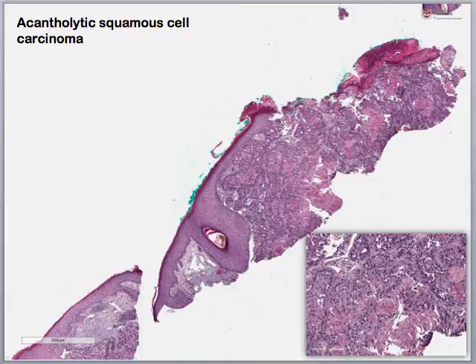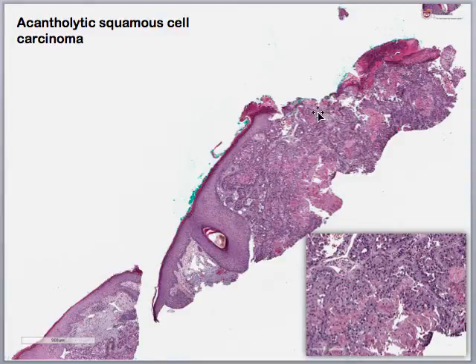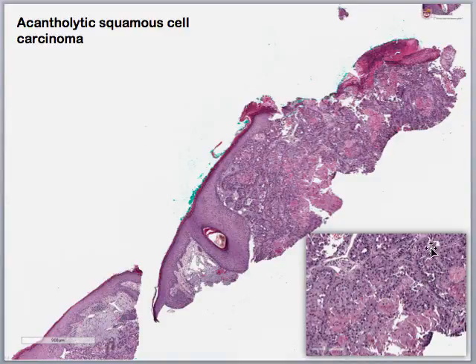On low power view we see an ulcerated lesion with cells originating from the epidermis and expanding into the dermis. Within these cells you have areas of acantholysis, highlighted by white areas where you can see the slide underneath. On high power view we can see not only the acantholytic areas but also that these cells are very atypical. Atypical keratinocytes coming off the epidermis into the dermis with acantholysis gives us a diagnosis of acantholytic squamous cell carcinoma.